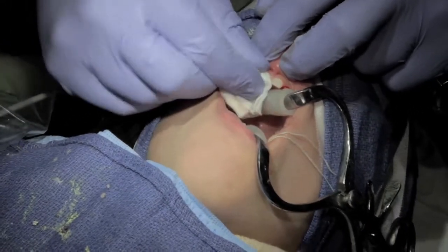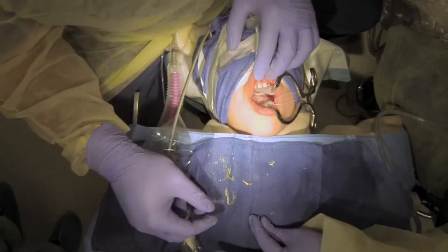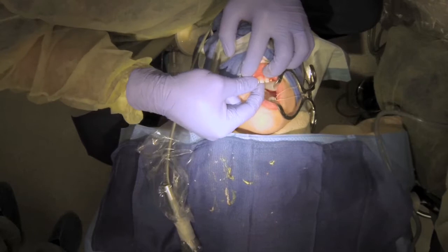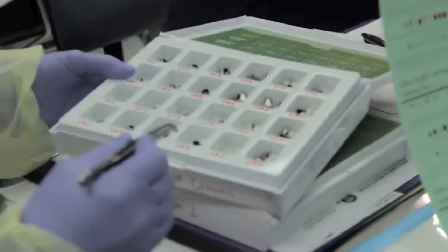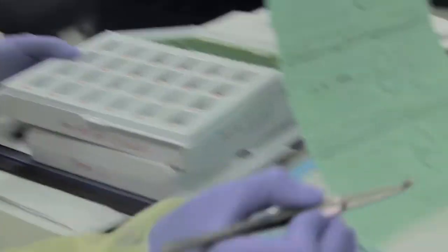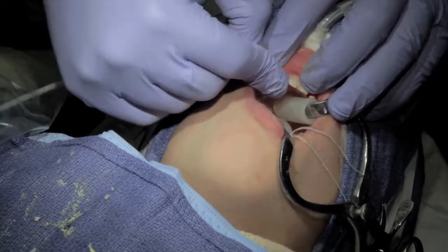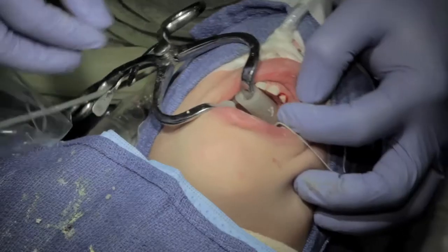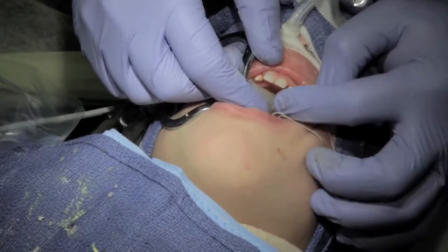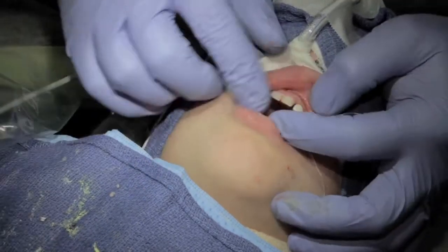I'm going to try on some crowns. Let's try a right lateral — let's go with a size four. Just to check, I also try a size three. The size threes more closely resemble the original shape and size of the teeth. As you notice, there's some pretty decent gapping everywhere, so you want to try to reproduce as closely as possible the original size, which you can do pretty easily. That fits pretty nicely, so we'll go with the threes.